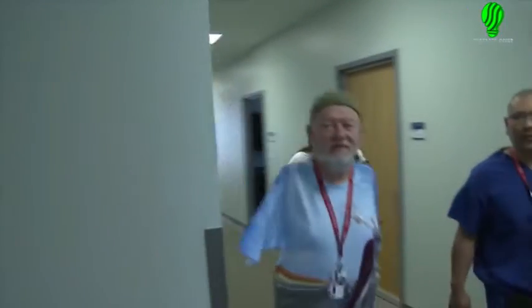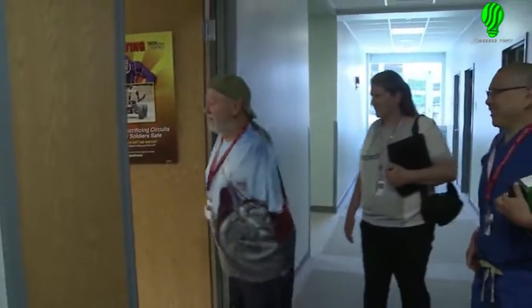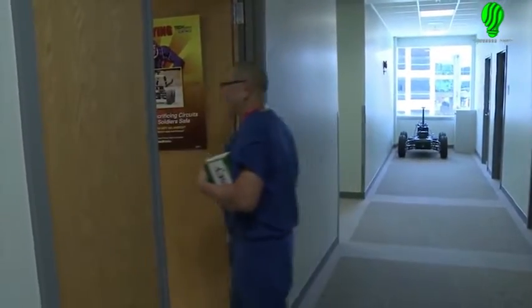Les had lost both limbs in a freak electrical accident over 40 years ago and is excited to become the first shoulder-level amputee to have the MPL fully and wirelessly integrated into his body.